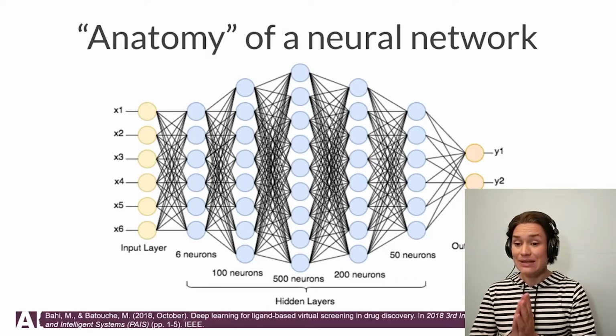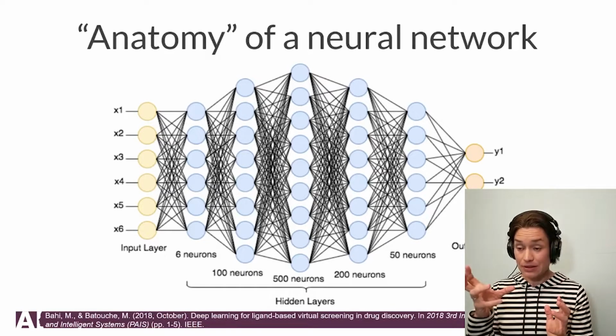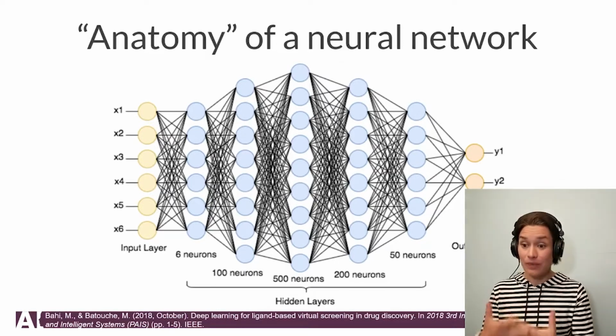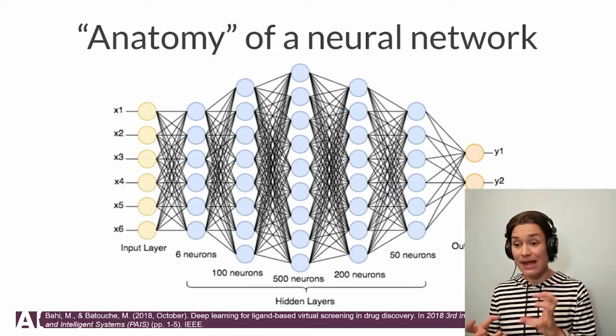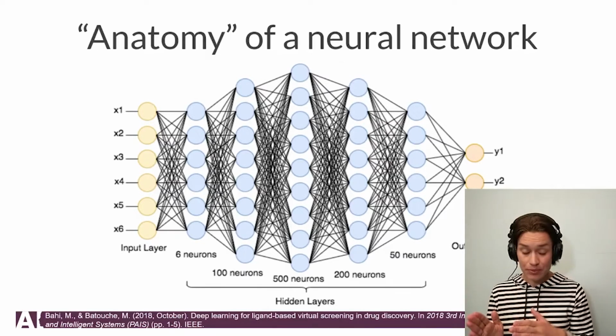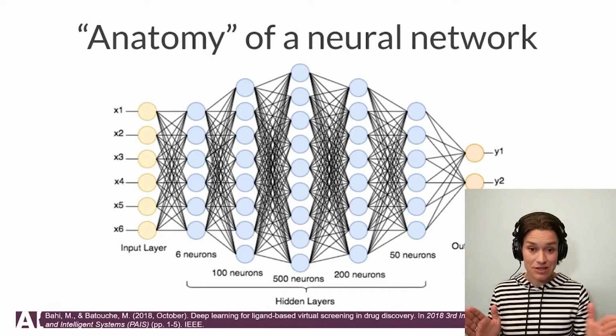But basically, this network is comparing the input to the output, given the labels we have provided, checking if the output makes sense and adjusting the strengths of the connections of different features of those neurons. The training consists in adjusting those weights, so finding the best features to go from an input to an output, from the picture of a car to the classification, this is a car.